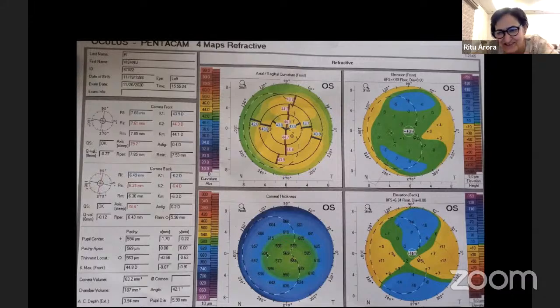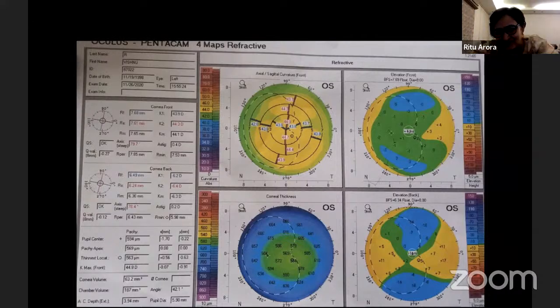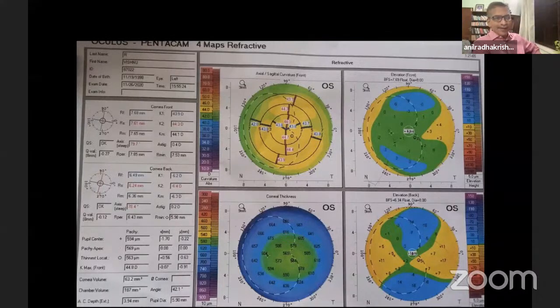What is this irregular pupil dilatation? I am not sure, ma'am. I think it is pupillary marking only, no? Because normally the pupil marking comes as a circle, and here it is coming a little eccentric and irregular. Either this patient had some kind of posterior synechiae or maybe it is partly dilated while preparing for refractive surgery. Maybe it was repeated or something.